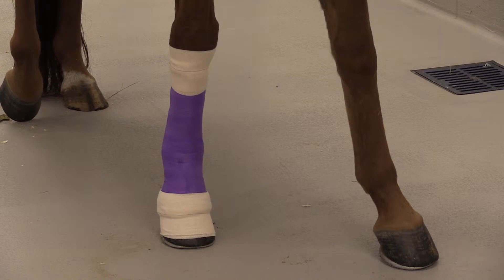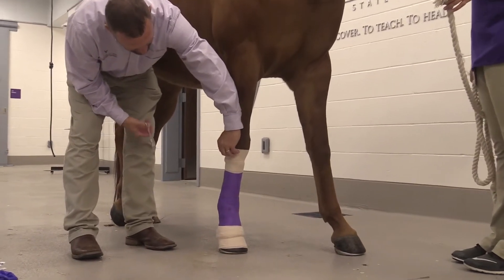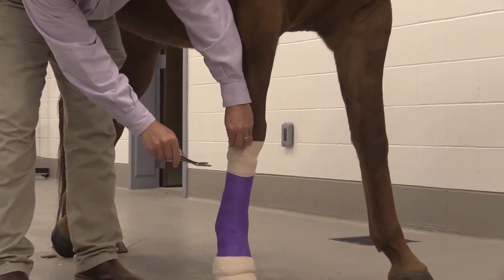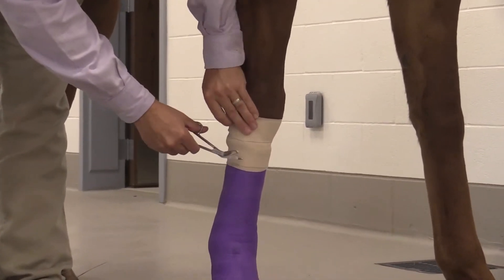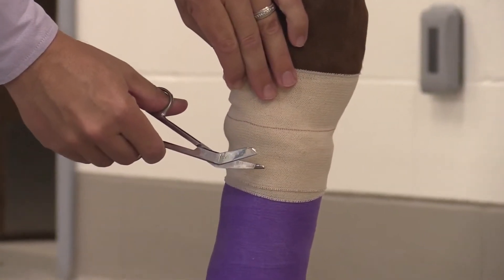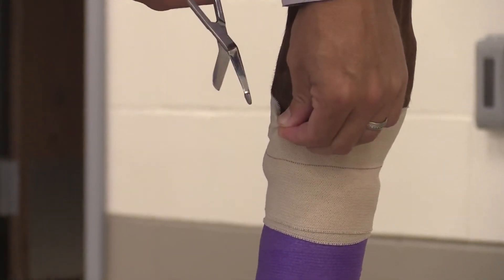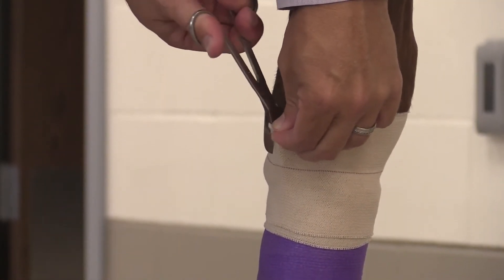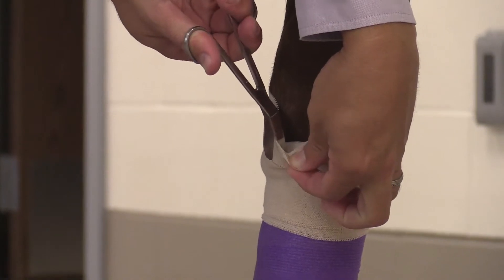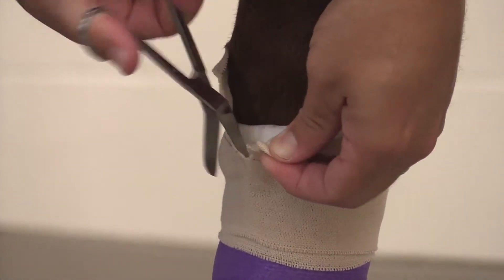This is a disposable bandage material — disposable because it will need to be taken off. Usually these bandages stay clean and supportive for about two to three days and then need to be removed and replaced if needed. All of that is at the discretion of the veterinarian who is helping prescribe whatever bandage your horse needs.